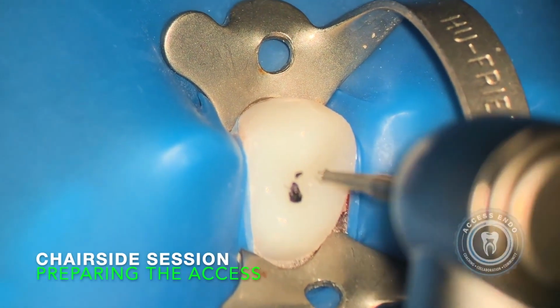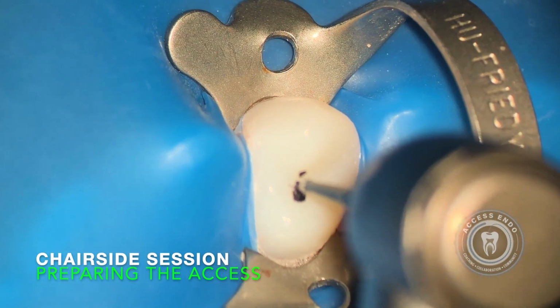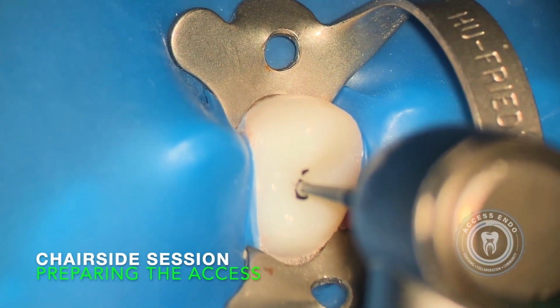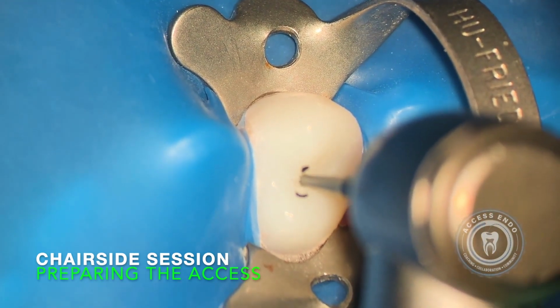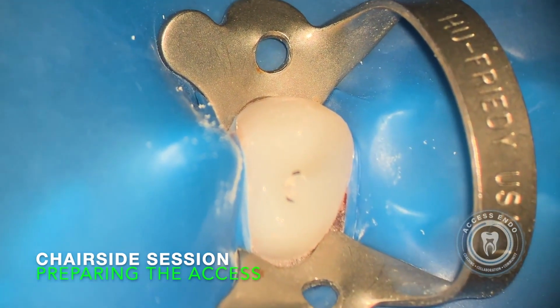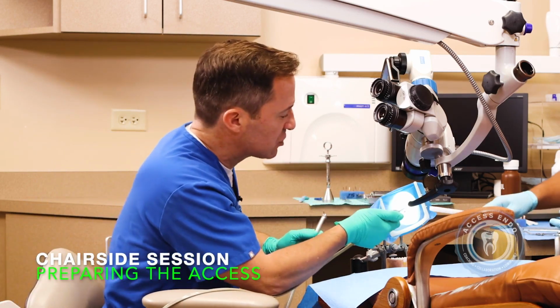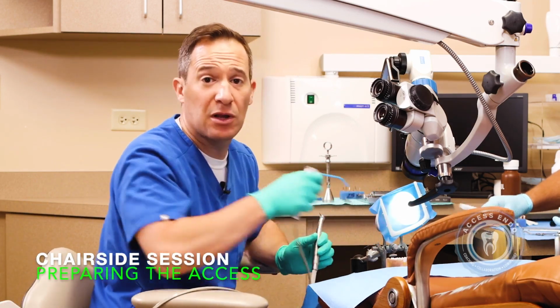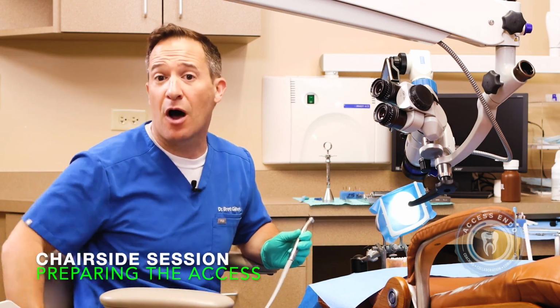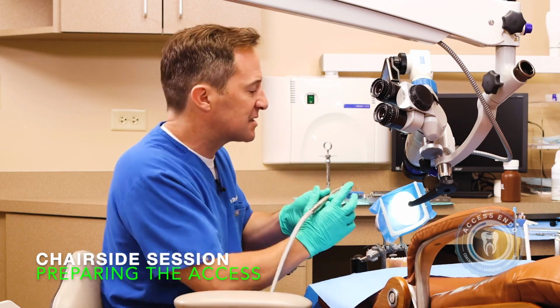Just like you would do, I'm going to get spinning here and get started. I'm going to start to go into the enamel, into the dentin, and make almost like a little mini access form. I always think it's important to look away several times so you can make sure you didn't commit to a long axis or approach that was off. By coming away and looking back, you get a constant reassessment.